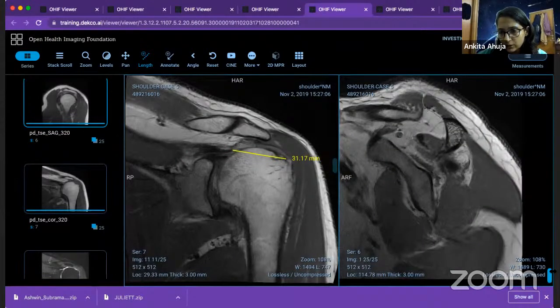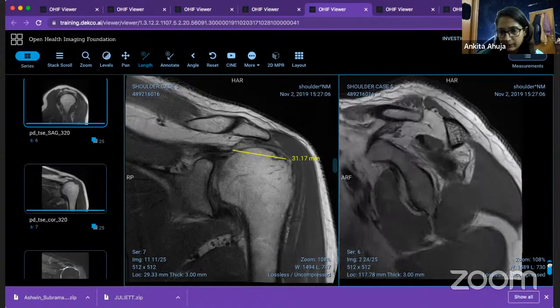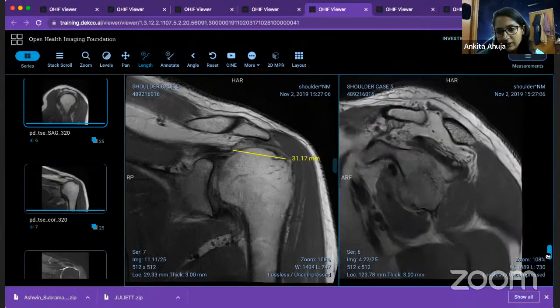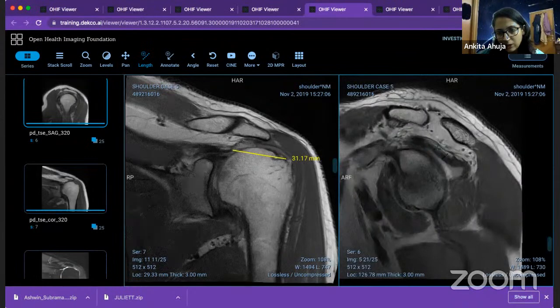Now we move on to this. So how would you figure out whether infraspinatus is torn alongside or not? So this is your supraspinatus and this is your infraspinatus tendon. Now keep an eye on this one. Now this is merging and forming a conjoint tendon. Yeah, but we have to figure out that almost from this point was infraspinatus by going a section back and forth, right? Now we keep an eye on that image. So it was almost here, right?